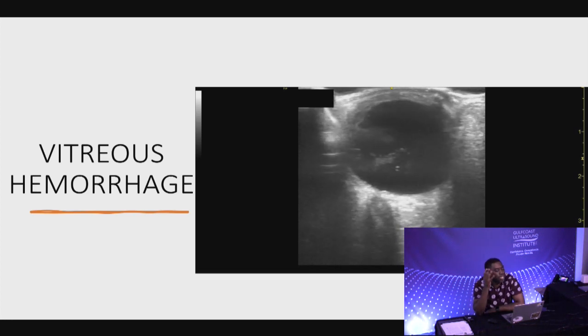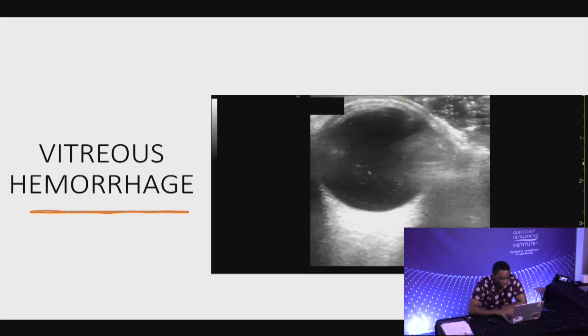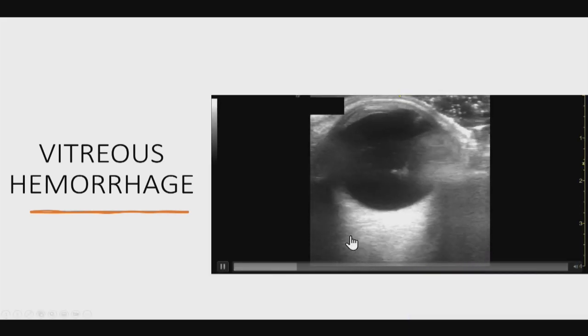I remember one time the patient was asking me, hey, what's going on? Apparently I spent too long looking at the eyes because I was mesmerized with the swirling going back and forth, and I forgot I was actually doing a visual exam. So it can be quite interesting to look at.